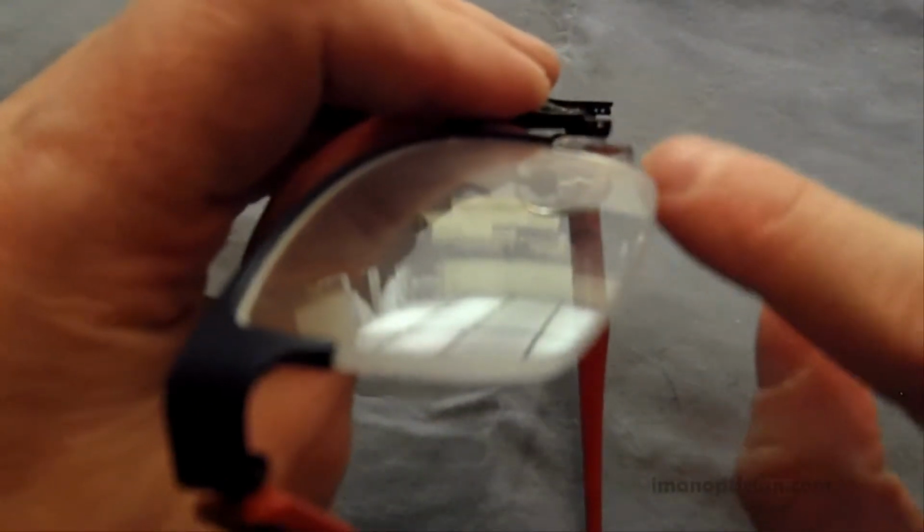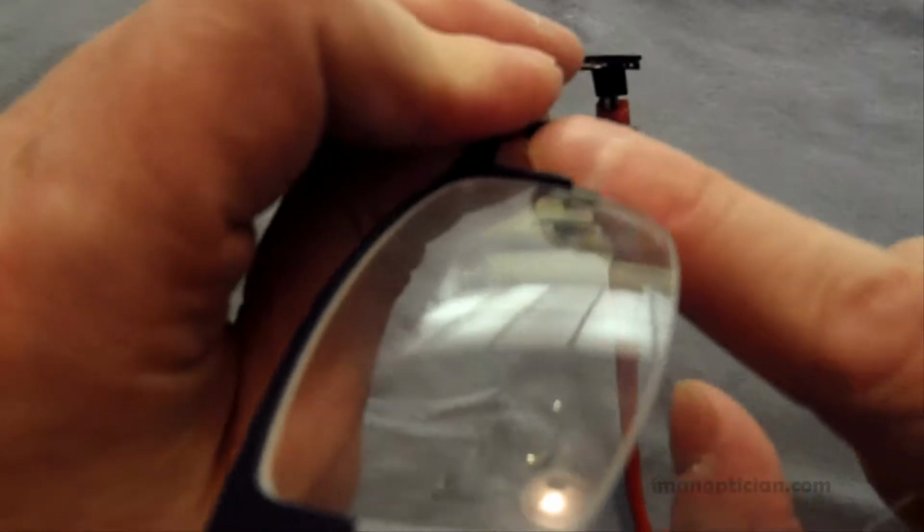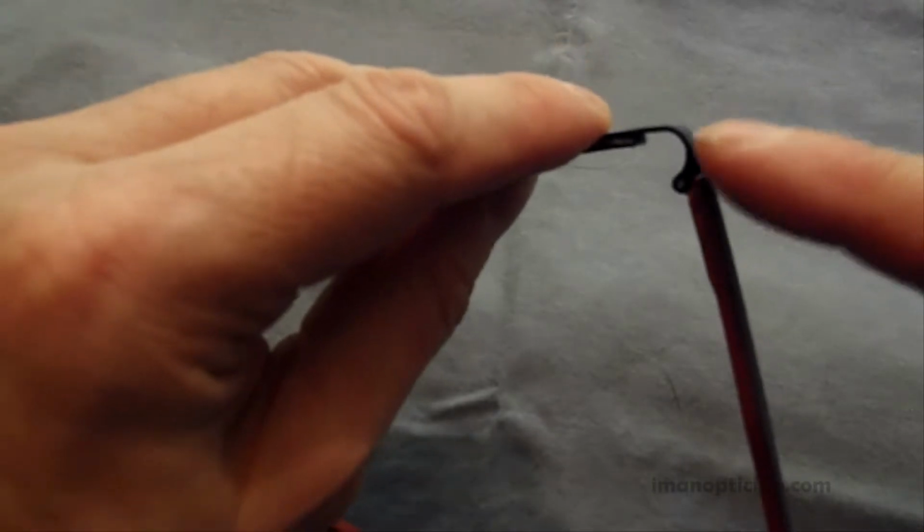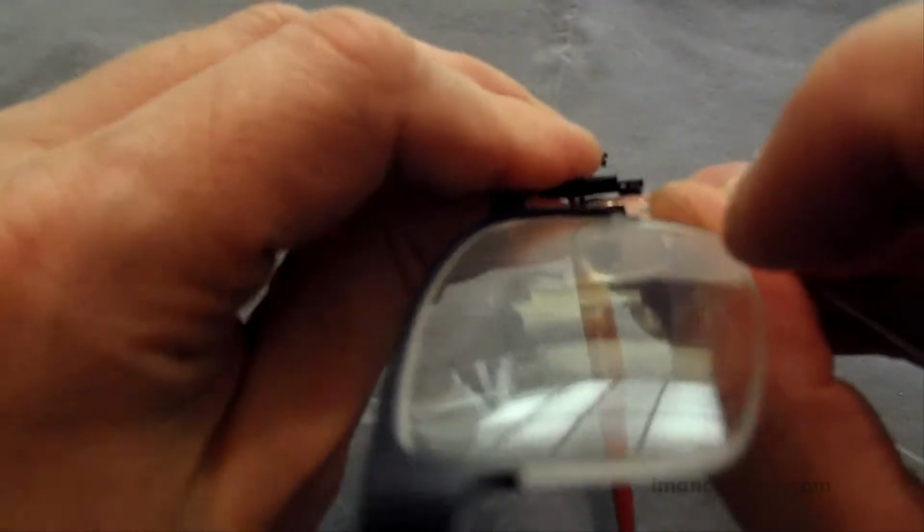You want to start with the side that has the easiest access. So here at the nasal, we've got a lot of room to get in. Here at the temple, we're restricted by how much the front of the frame here and the turn back temple here is giving us some restriction of access to those. So we're going to start here in the nasal, and you want to go to the inside of the frame through the bottom hole. You want to go in the bottom hole and all the way across, and then you're going to go out through the temple through the bottom hole, just like this.